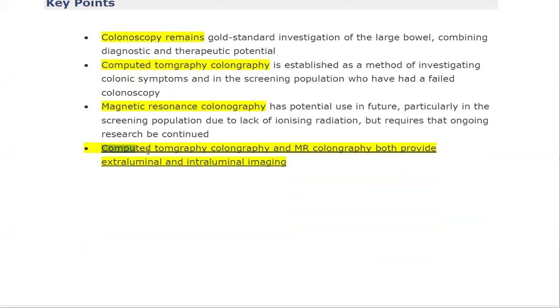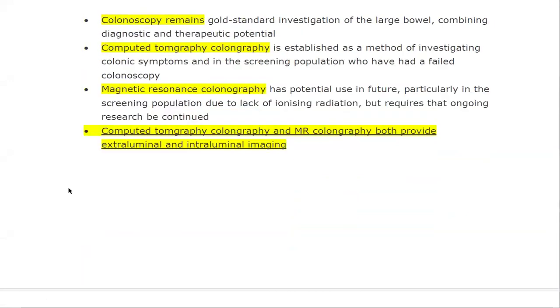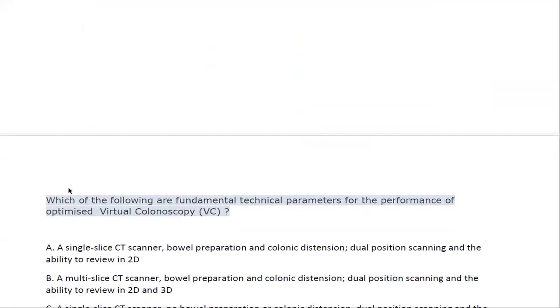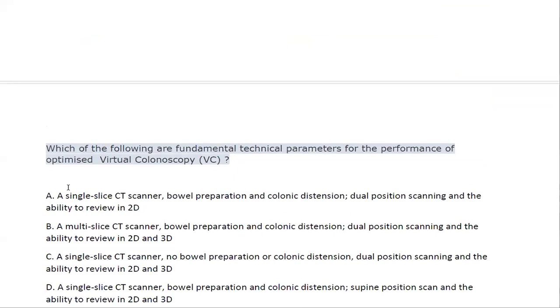The important issue here regarding CT and MRI is that they both provide intraluminal and extraluminal imaging. And here, after this, we are going to go to the part of the questions. We finished most of the content. Okay, so this is the first question here.